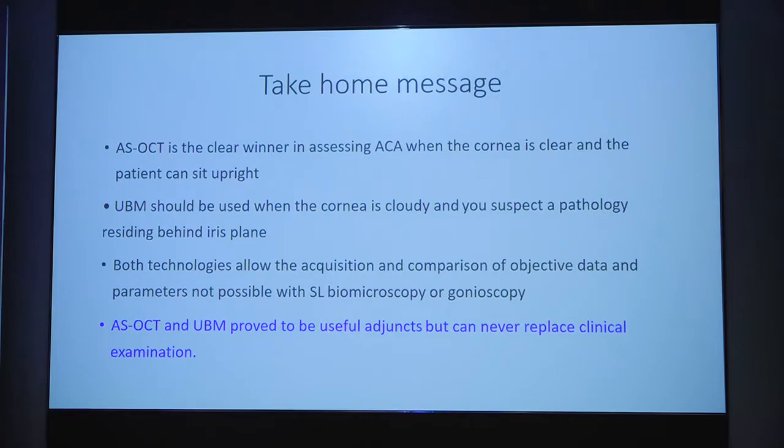So the take-home message would be: anterior-segment OCT is a clear winner in assessing the anterior chamber angle when the cornea is clear and the patient can sit upright. UBM should be used when the cornea is cloudy and you suspect a pathology which resides behind the iris plane. Both these technologies allow the acquisition and comparison of objective data and parameters, which is not possible either by slit lamp biomicroscopy or by gonioscopy. So ASOCT and UBM prove to be useful adjuncts, but they can never replace the clinical examination by gonioscopy.